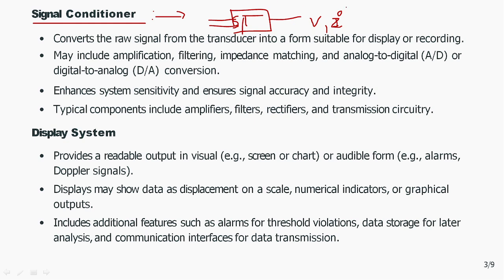These signals, as they are generated at different parts of our body due to physiological phenomena, we are collecting from the surface of the body by non-invasive or minimally invasive electrodes. So their amplitude is very low. We may get the values of this signal in microvolts or millivolts, so we need to amplify them. So two things are happening here in this signal conditioning block.